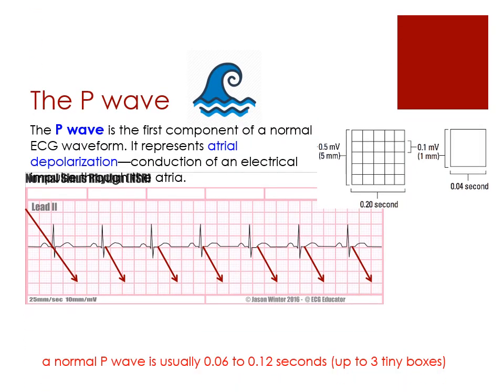So let's look at the P wave because that's the first one. Now when you look at EKG paper, you'll notice that there's a lot of boxes. There's little boxes, individual boxes, and then there's a set of boxes, and that's where the bolder lines come in. All of those boxes mean is just a unit of time.